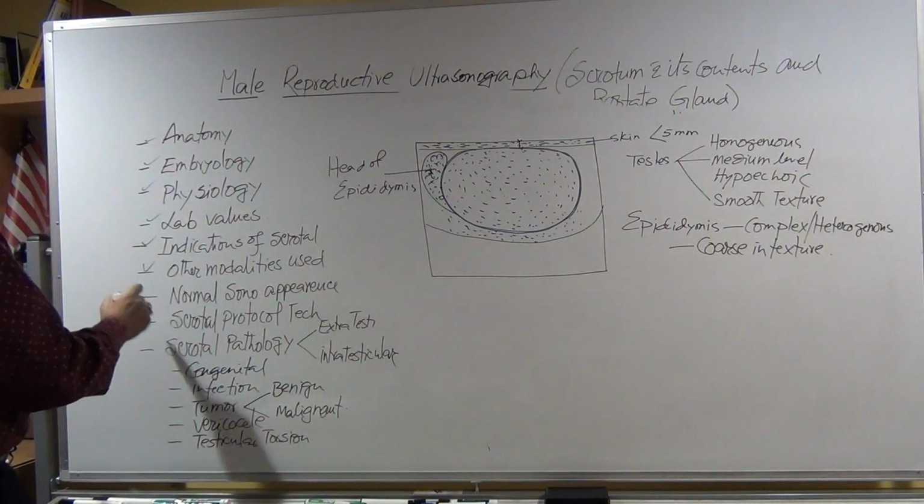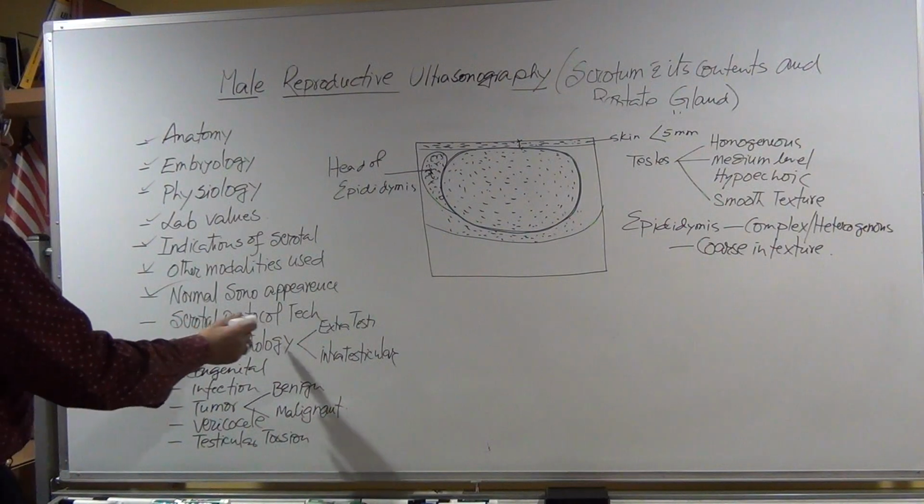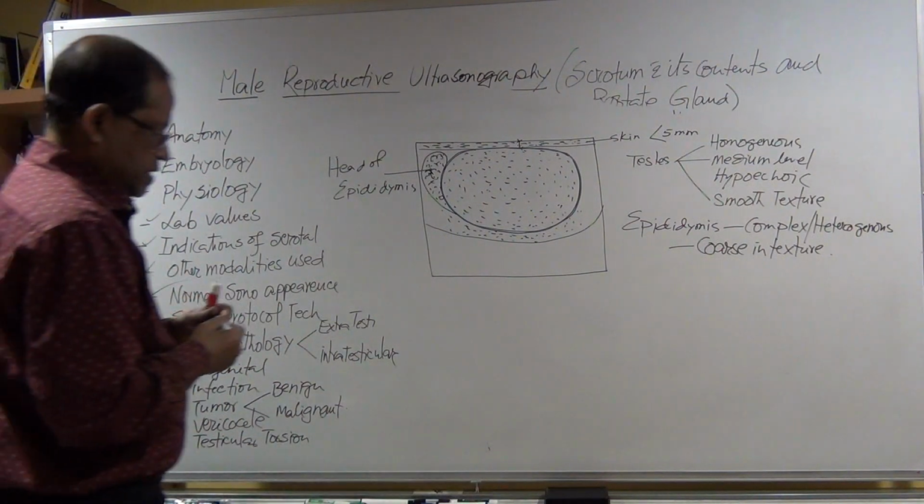Okay, so normal sono appearance, then scrotal pathology protocol technique.